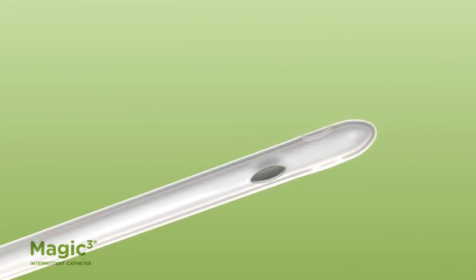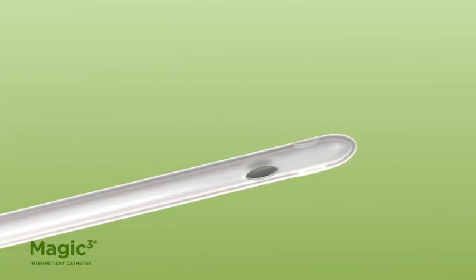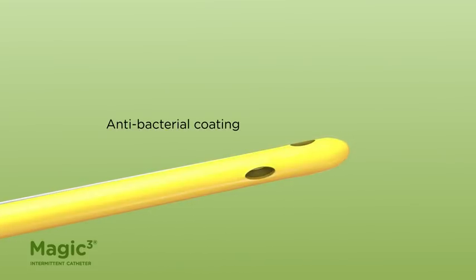The catheter's outer surface may or may not have a coating on it. The catheter is also available with an antibacterial coating.